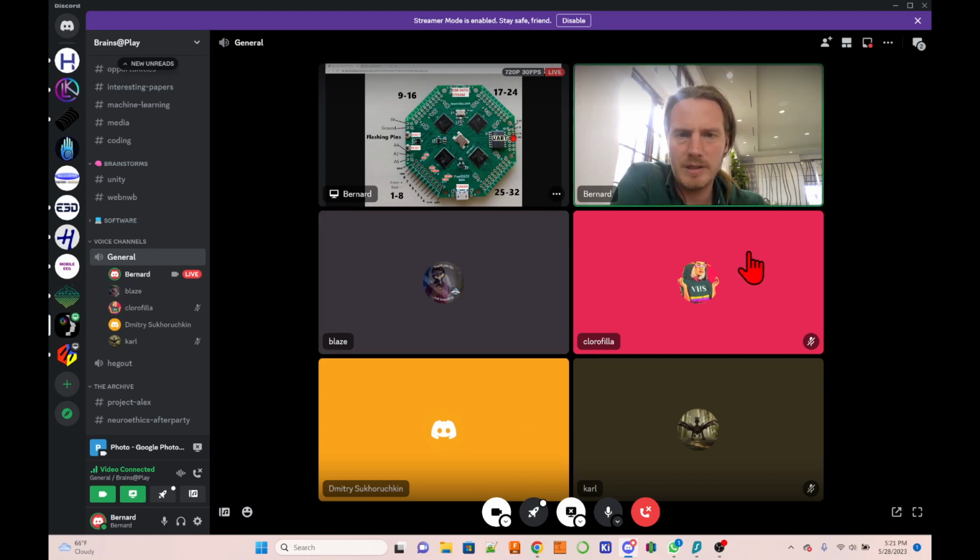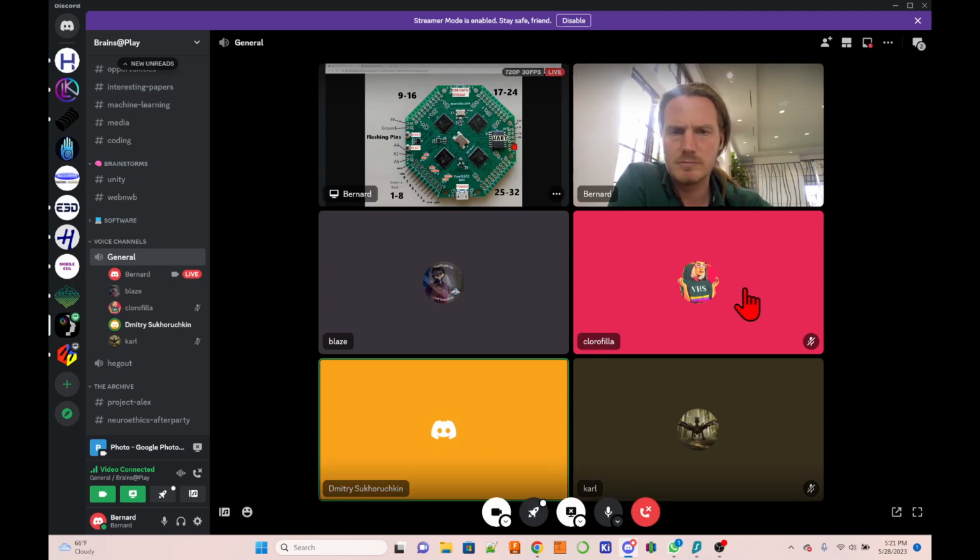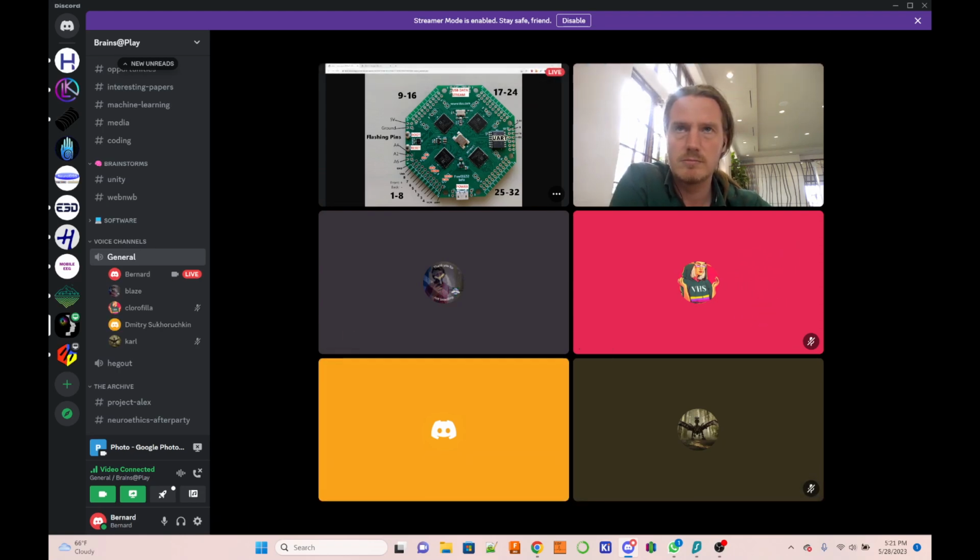And then I have my optical components here, which require 5 volts. But if your optical components have noise, it will be on your power. It sounds very fancy when I say optical components, but it's just an LED, and one capacitor is also there. It can provide noise, some frequency.